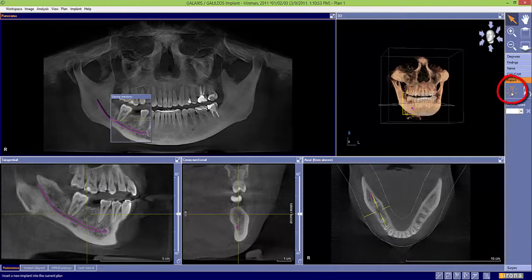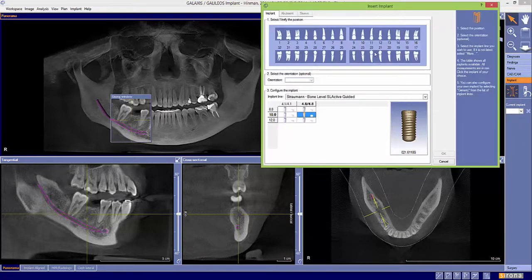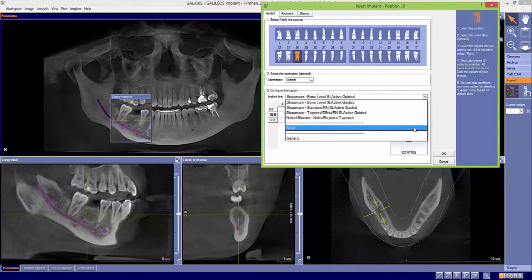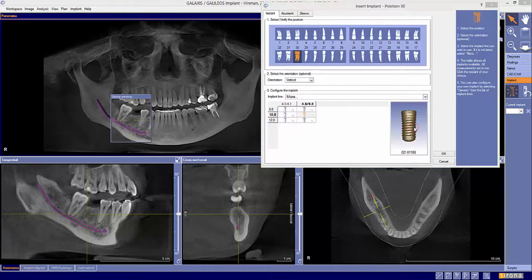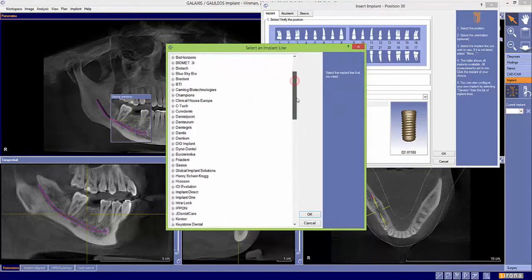Select your shiny implant icon, then the tooth number. Leave orientation vertical, then select your implant. Here's your library.